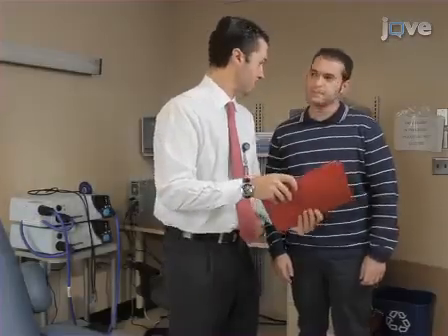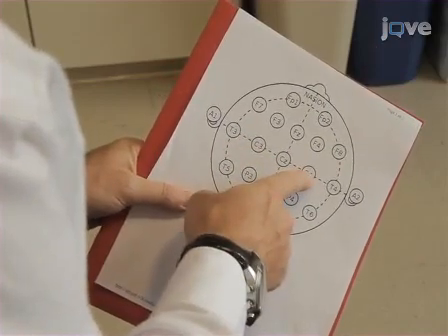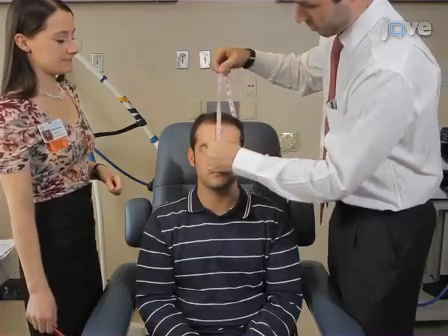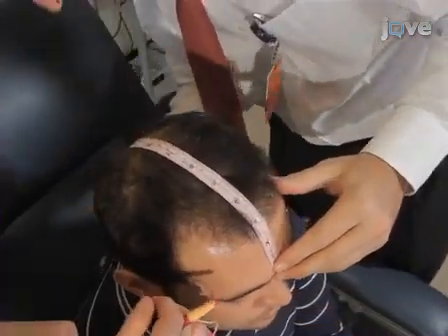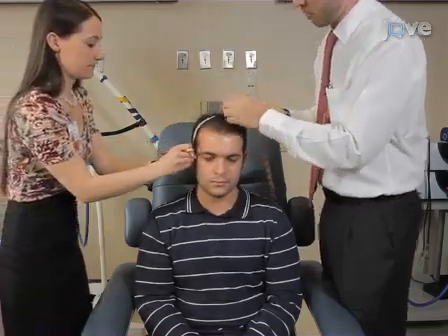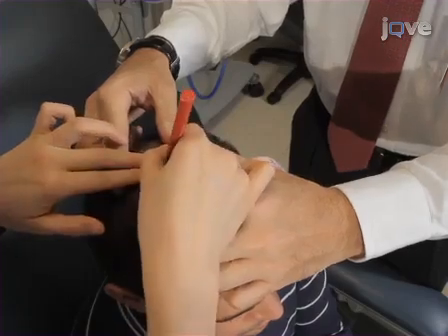When the subject arrives, have him or her sit comfortably in a chair to begin measurements for electrode placement. The stimulation location will be found by measuring distances on the scalp, usually using the convention of the EEG 10-20 system. To localize the vertex, first measure the distance between the nasion — the point between the forehead and nose at the junction of the nasal bones — and the inion, the most prominent point of the occipital bone. Mark the halfway point, then measure the distance between the preauricular points over the marked midpoint, and mark the halfway point along this auricular line. The intersection of both marked points is the vertex.